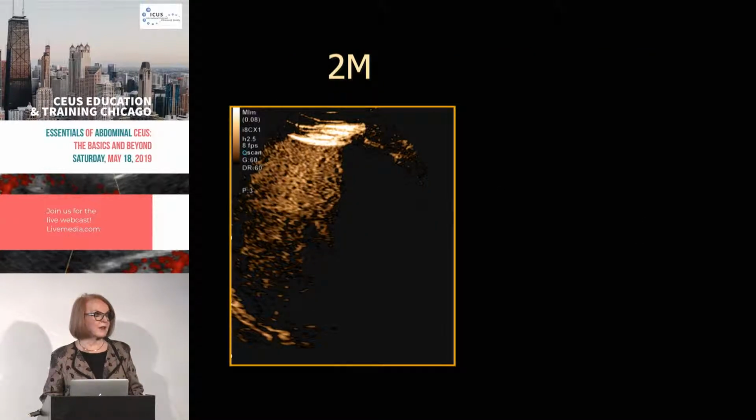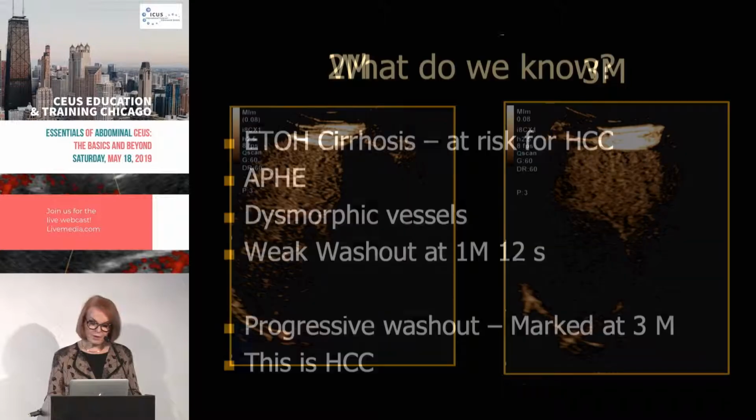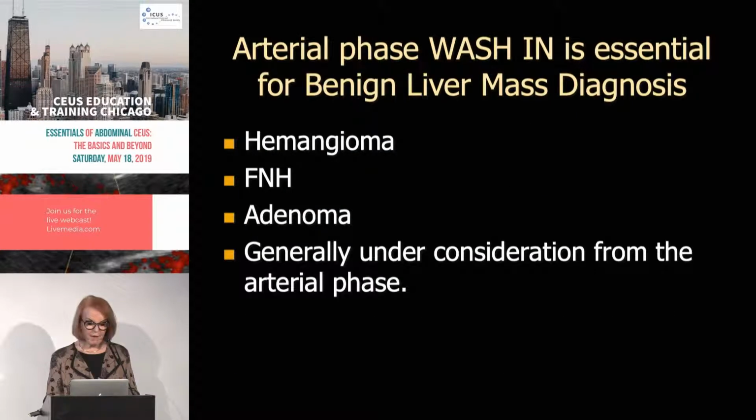And of course, patients get so big, as you know, that some of them don't fit into CT and MR gantries either. So that's not a slam dunk that you can always go to CT or MR scan. But you can see this increasing washout. This is a very typical appearance of washout, where it's originally weak, like on the left-hand image where there are still bubbles left inside the washout area, or it can go completely black. So that is HCC.